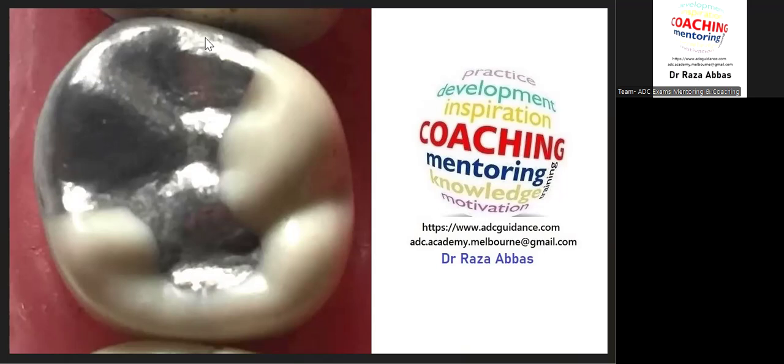You cannot just fill it, right? You need to create some anatomy, but I see candidates emphasizing so much on anatomy and neglecting the other key components, which is the contacts, cusp position, tooth restorative junction, mesial ridge height, marginal ridge height. So just don't rely on anatomy so much. Anatomy to some extent, clinically acceptable, is fine by the ADC examiner.